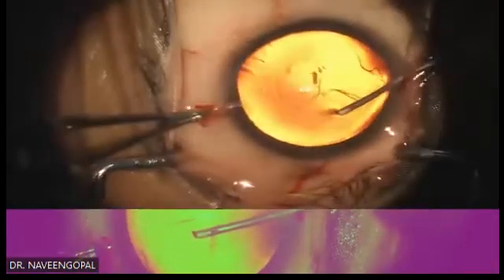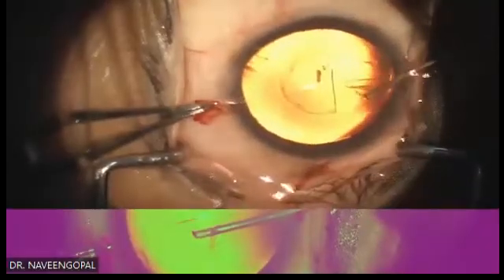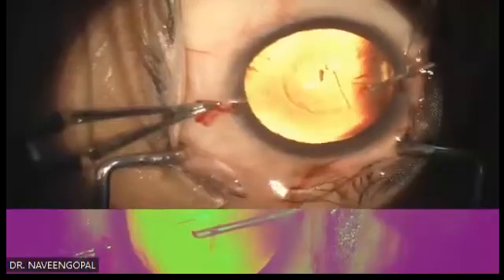Okay. Yeah. Now it is coming. Yeah, I'm going ahead. So it was some problem with the focus. I hope everybody is seeing clearly.